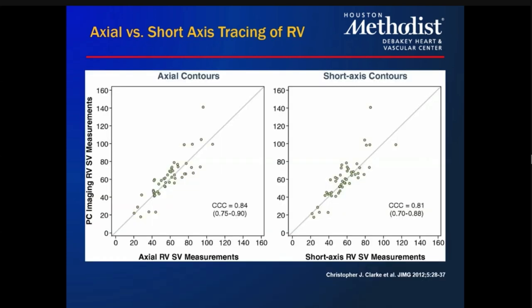Okay, and this is just showing how the axial stacks that I showed versus short axis stacks compare with phase contrast imaging of the PA stroke volume. Okay.